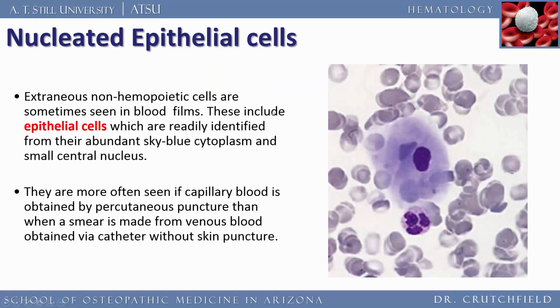So, platelet satellitism. Occasionally you'll see skin cells mixed in. So here's a polymorphonuclear leukocyte. Here's a great big giant skin cell, an epithelial cell. And you'll often see these on blood that's drawn peripherally, meaning that we stabbed you in the antecubital vein to get this, as opposed to drawing blood from a catheter where the blood is coming straight out of the circulation.